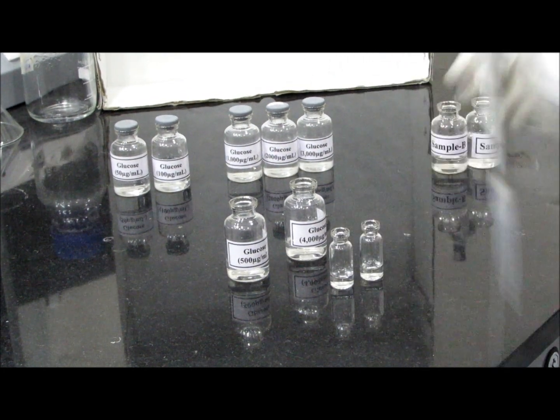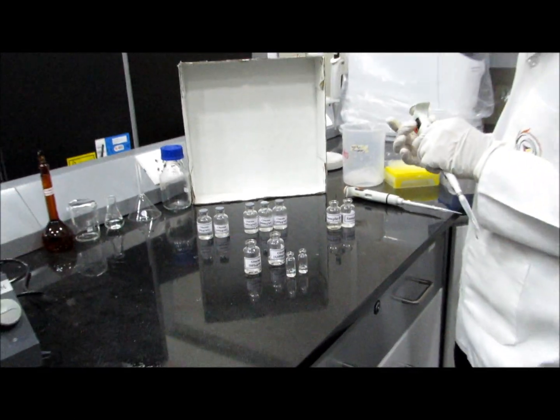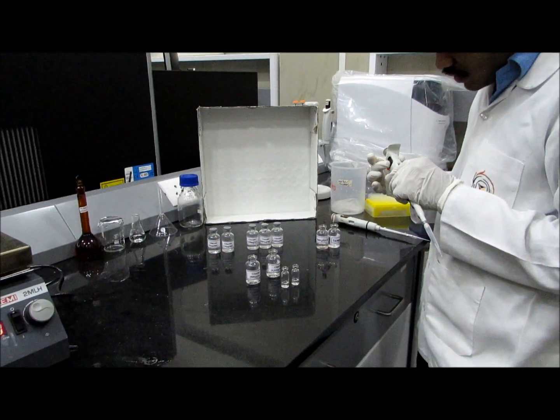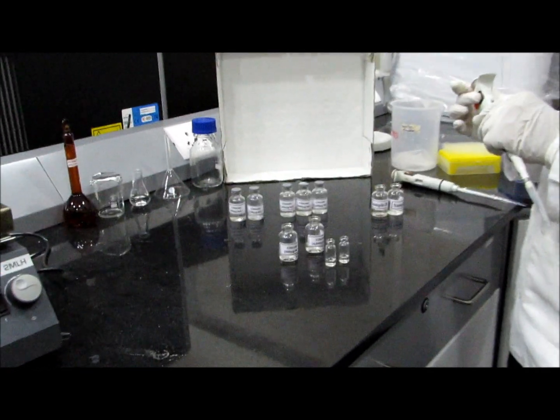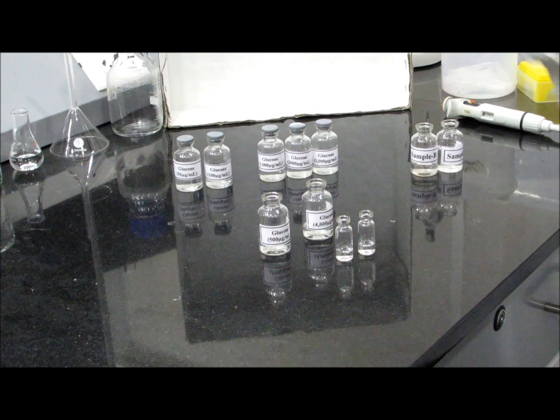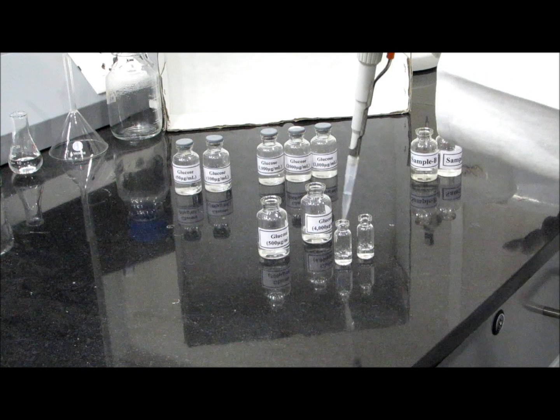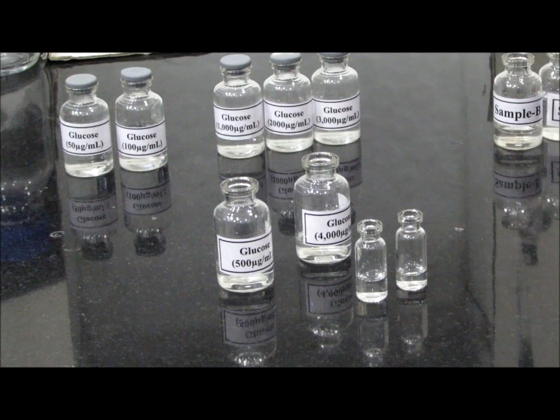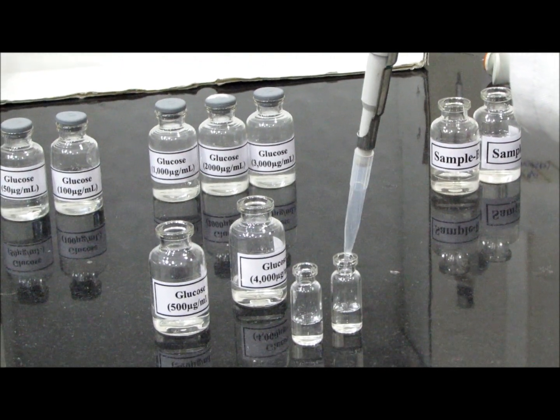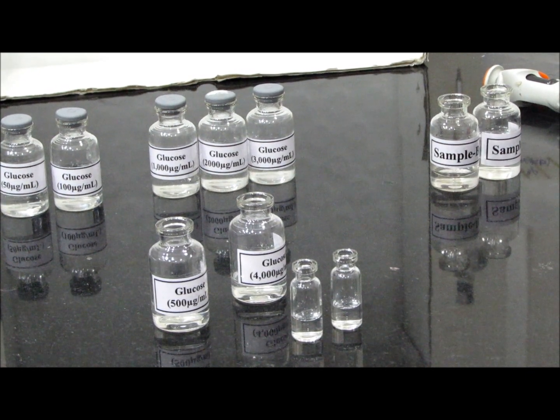After the addition of the standard glucose solution, I am going to add 500 microliters of catalyst which we have developed in our lab, which can sense the glucose level even in femtogram levels. Now we have added 500 microliters of the catalyst. Now the next step, we have to add the accelerator which initiates the reaction.